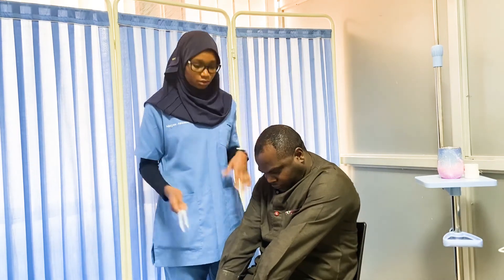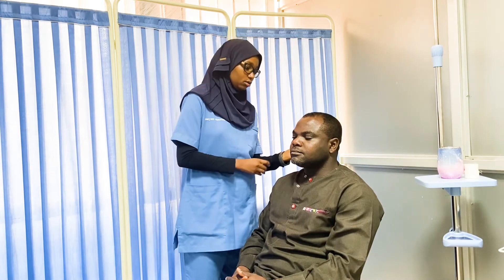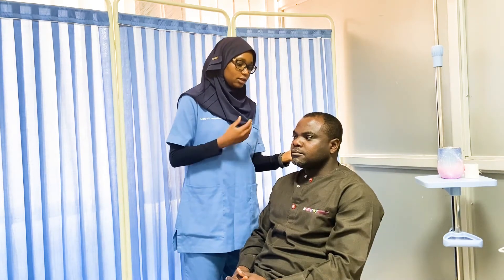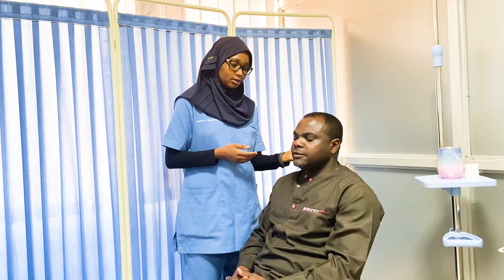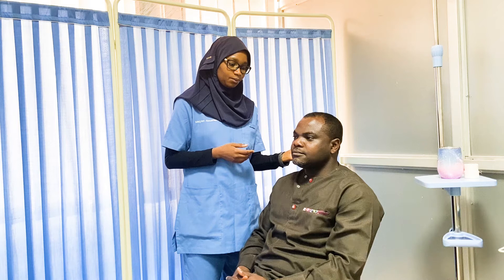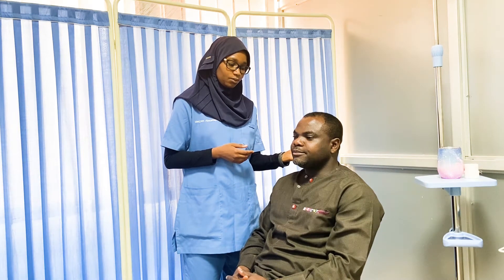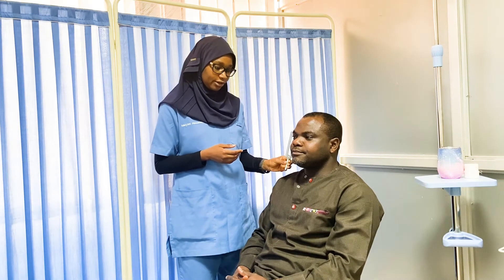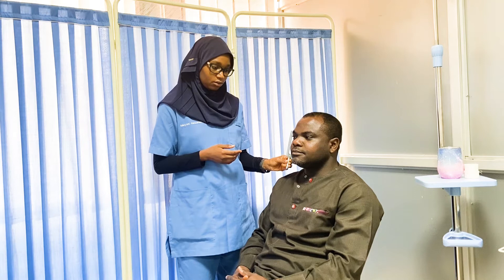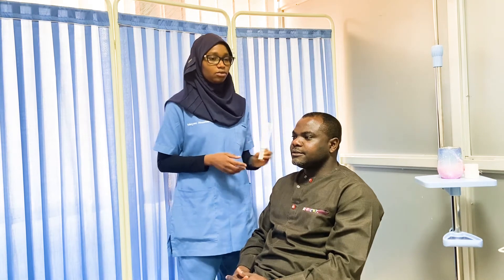We'll demonstrate a normal test now. Can you hear it? Yes. Tell me when you stop hearing it. Can you hear it now? Yes. Okay, thank you.